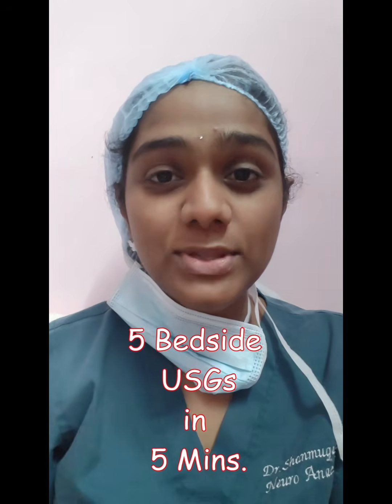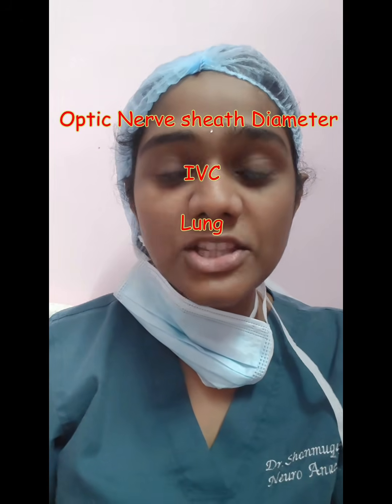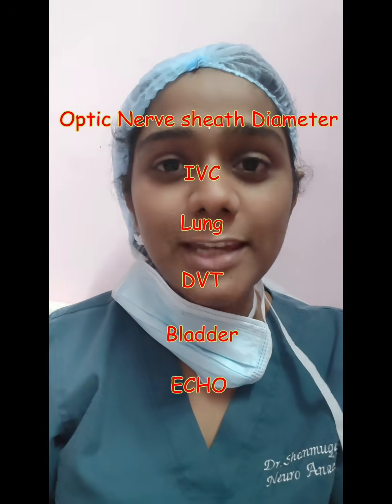Hi everyone, bedside ultrasound is an important clinical decision-making tool which every neurocritical care resident should know. In this video, we are going to see 5 bedside ultrasound scans from head to toe in 5 minutes, which is going to include optic nerve sheath diameter, IVC, lung, checking for DVT, bladder and echo.